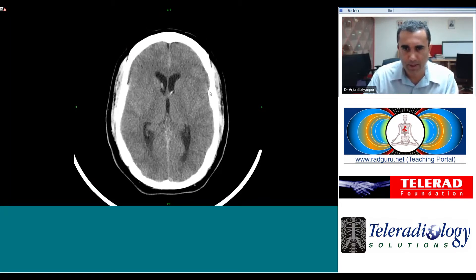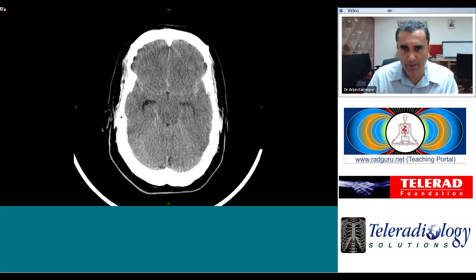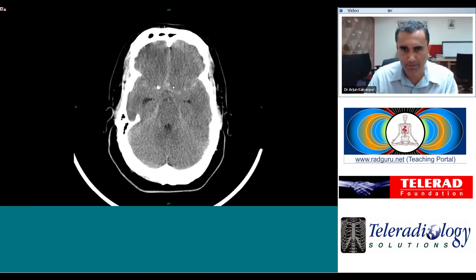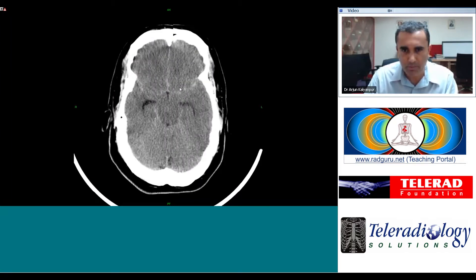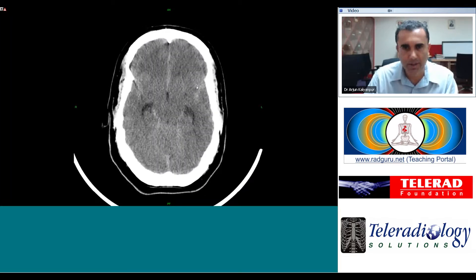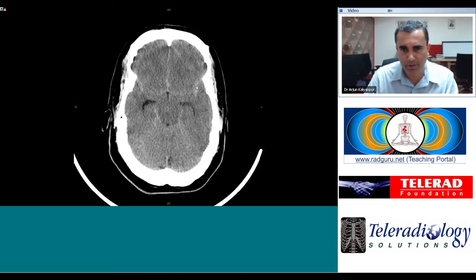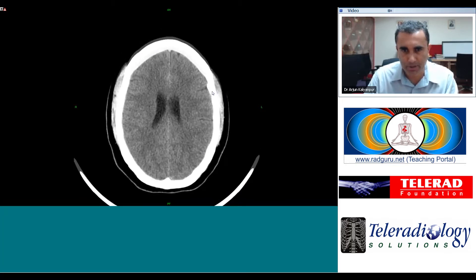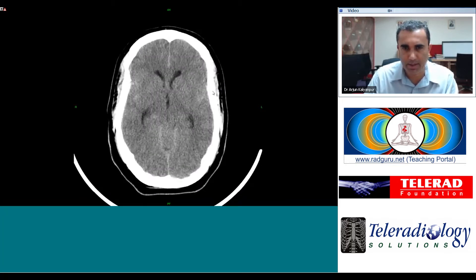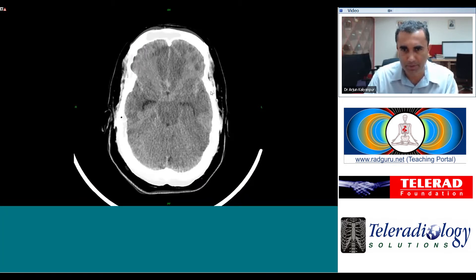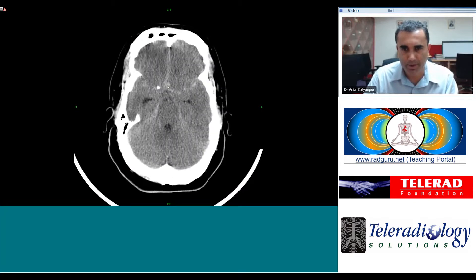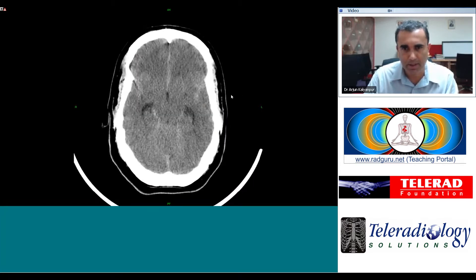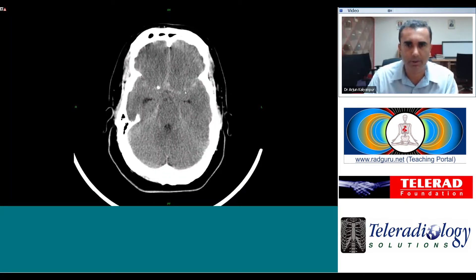When we look further, there is a focal small collection of clot in the anterior inter-hemispheric fissure. Subarachnoid hemorrhages that are symmetric about the midline, as this one is, are usually related to midline aneurysms. When we see this kind of appearance, it is more likely than not that the source is a ruptured anterior communicating artery aneurysm, and this is the location for that vessel.